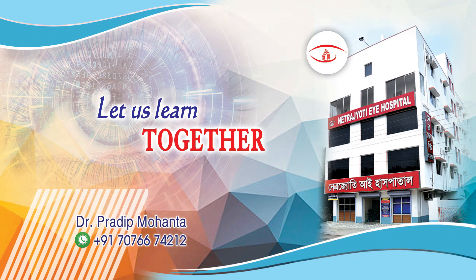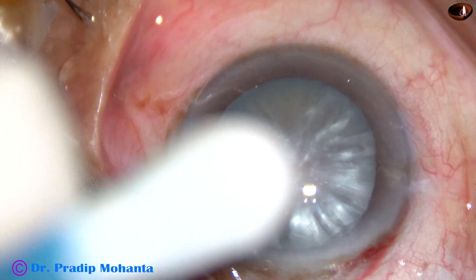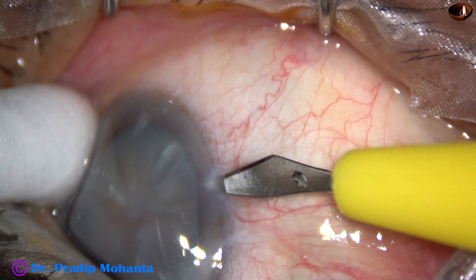Friends, welcome to my workplace at Rana Ghat, West Bengal, India. This is an intumescent cataract with very hard nucleus. Let us observe this surgery.